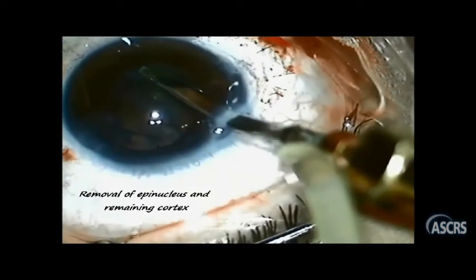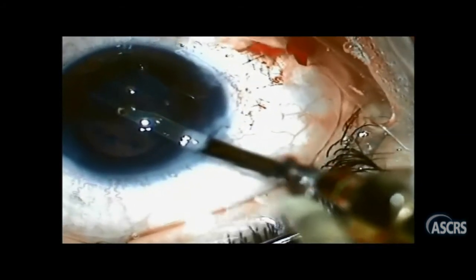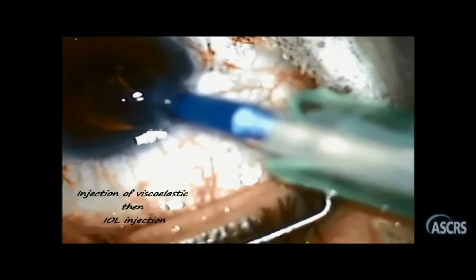Finally, the iris is back in place, the scleral flap bed is sutured, and back to phaco. Cautiously, I removed all remaining lens matter using the Simcoe cannula, implanted the IOL, sutured the main wound with a single stitch just for safety, and finally removed the viscoelastic material and performed stromal hydration of all wounds.